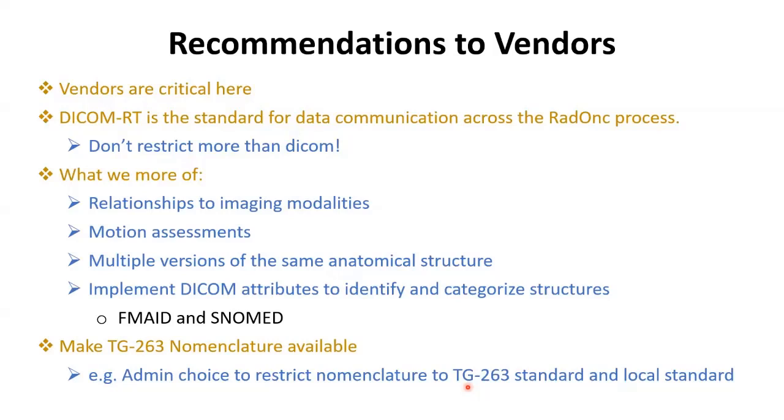and even as recommended by the report, they don't use PTV with a certain dose. You use it as high, mid, and so on. So you could use PTV high, regardless of the dose, and you show the physician that plan. If he's happy, no issues. If he's not, you can decrease the number of fractions.